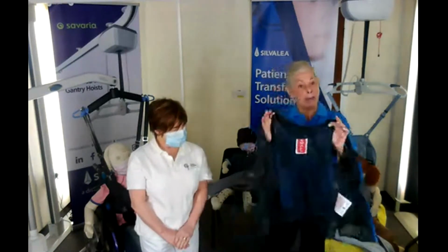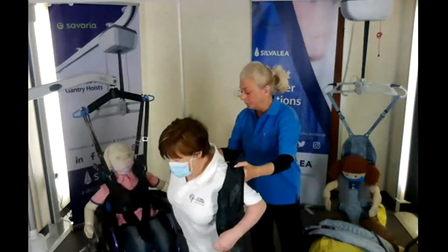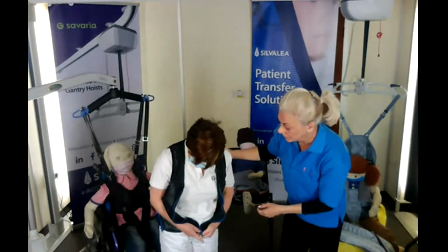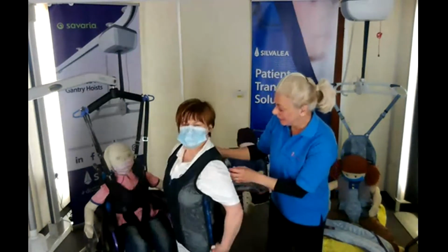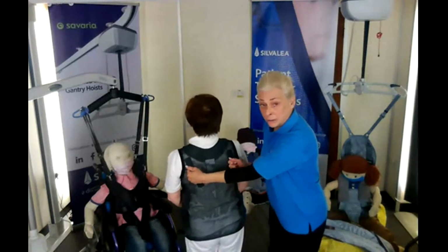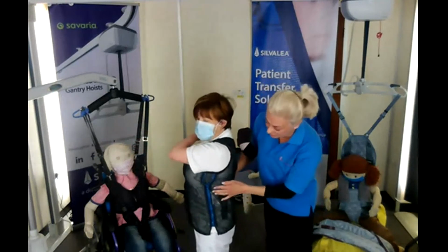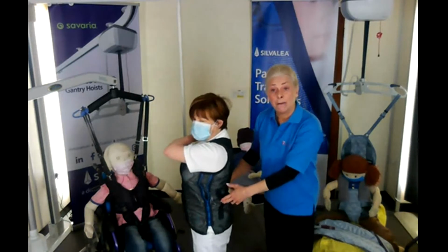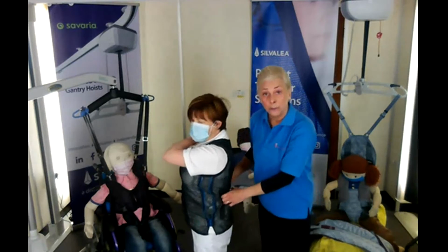It's a lightweight mesh, which just goes on like a jacket and zips up fully from the bottom. Judith's kindly arranged to be my model today. So we can see here, it fits like a jacket. We've got positioning handles to the sides there and on the hip. And there is a little zip both sides as an expander. So if they're wearing outer clothing, then we can undo the zip to give a little bit more room there.